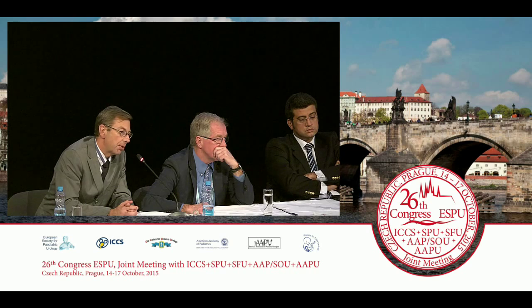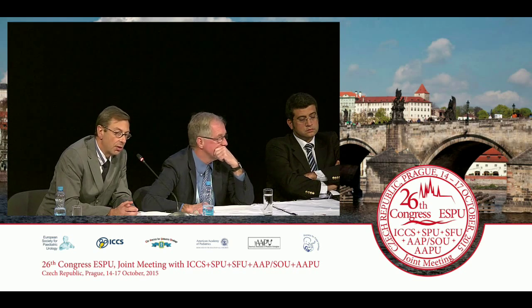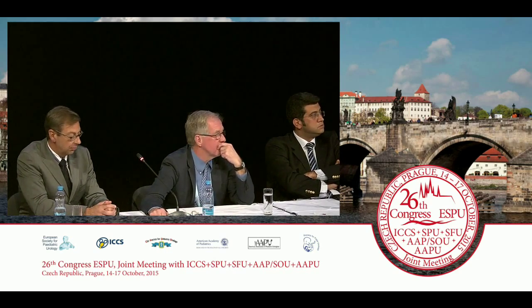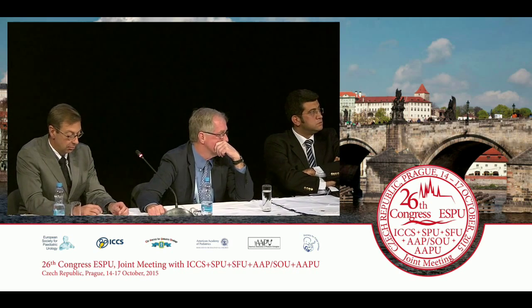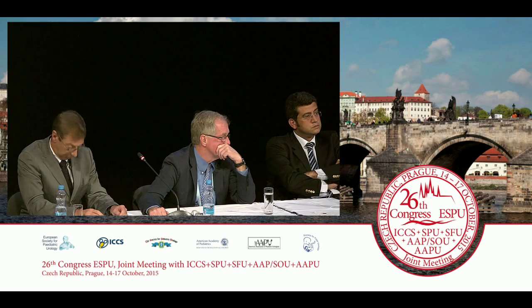We looked at it from a histology point of view, and they could only describe indeed large fibrosis, but no other explanation. Really? Actually, what is reported and what we've seen with Vantris injection as obstruction was in the long term. We've never seen any case in the short term, and I think 2 of those cases that I had very difficulty with were like 2 years after injection. So it's yet early because Vantris is being used quite recently. I don't think we have enough data to comment on this, but we have some initial results which makes us a bit cautious about Vantris causing obstruction.